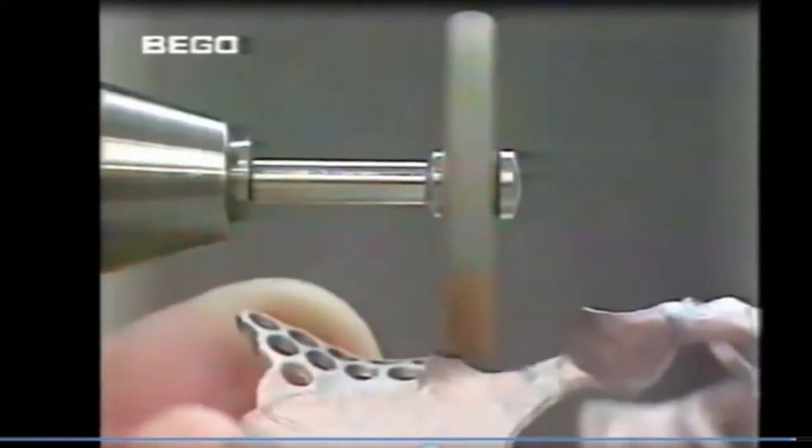Finishing can be completed with the high-speed grinder or the handpiece. Sintered diamond grinding stones have proven very effective for finishing cobalt chrome alloys with the handpiece. Diamond grinding stones are much more cost-effective than ceramically bound stones. In the interest of safety, the maximum speed of 30,000 revolutions per minute must not be exceeded.